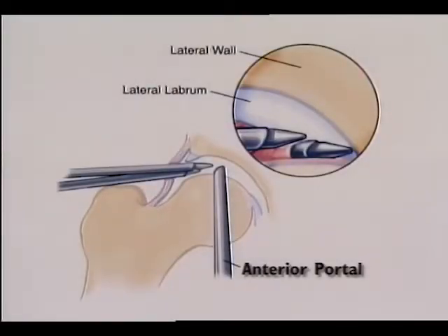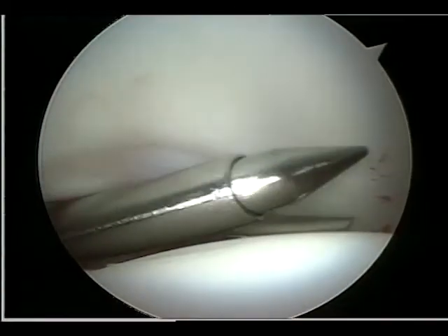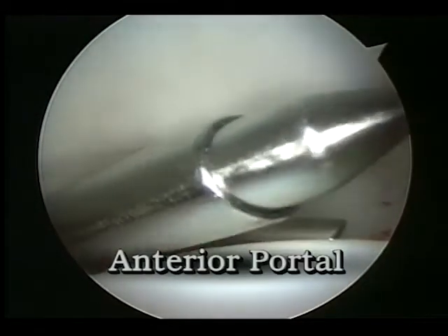The anterior portal provides a distinctly different perspective. The lateral labrum and the relationship of the lateral two portals are best appreciated from this position.